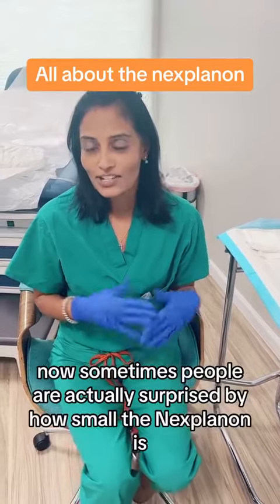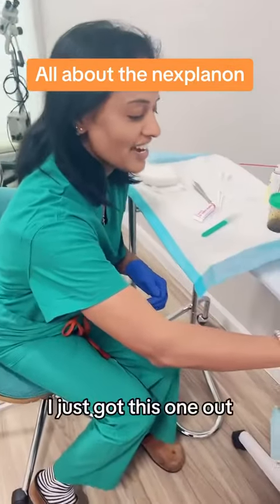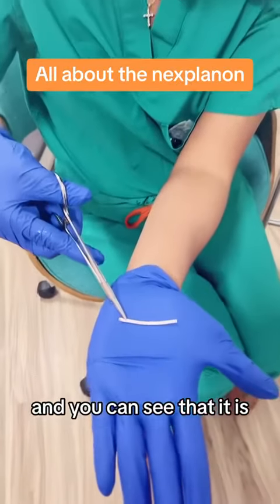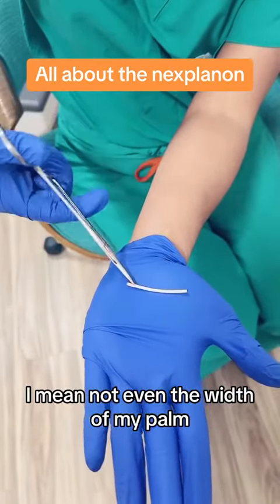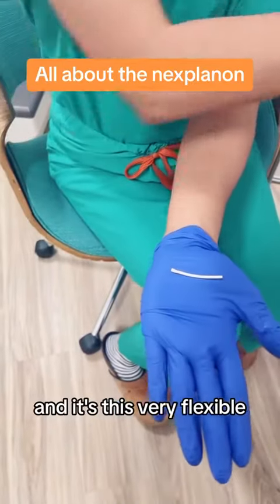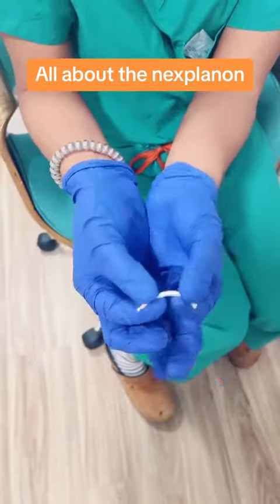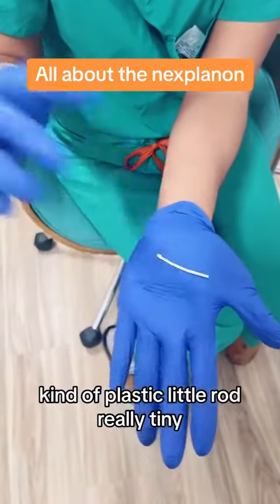Sometimes people are actually surprised by how small the Nexplanon is. So let me show you — I just got this one out and you can see that it is not even the width of my palm. It's really tiny, and it's this very flexible kind of plastic little rod, really tiny.